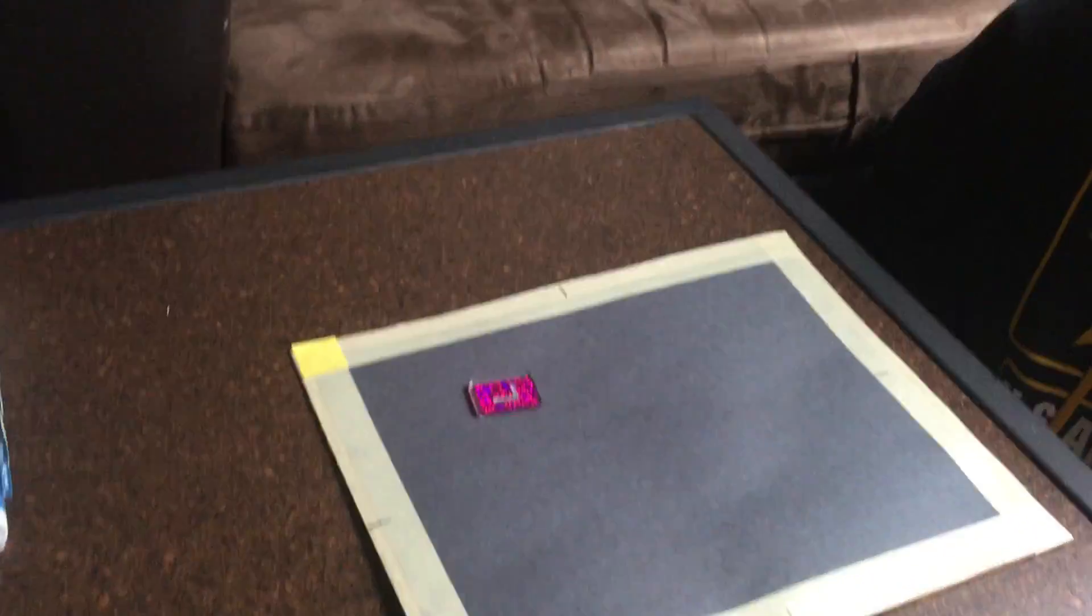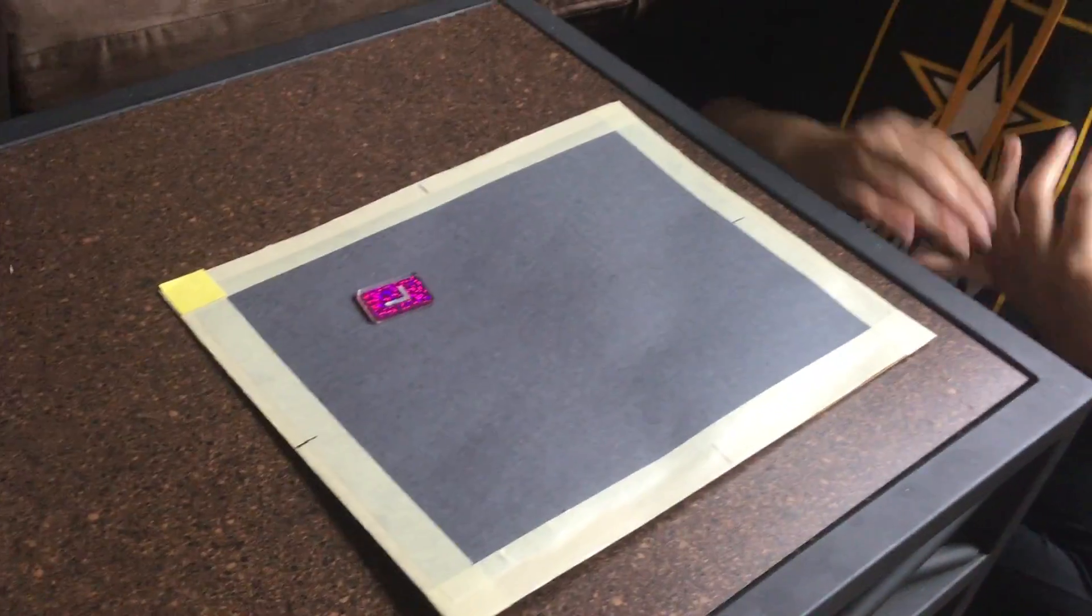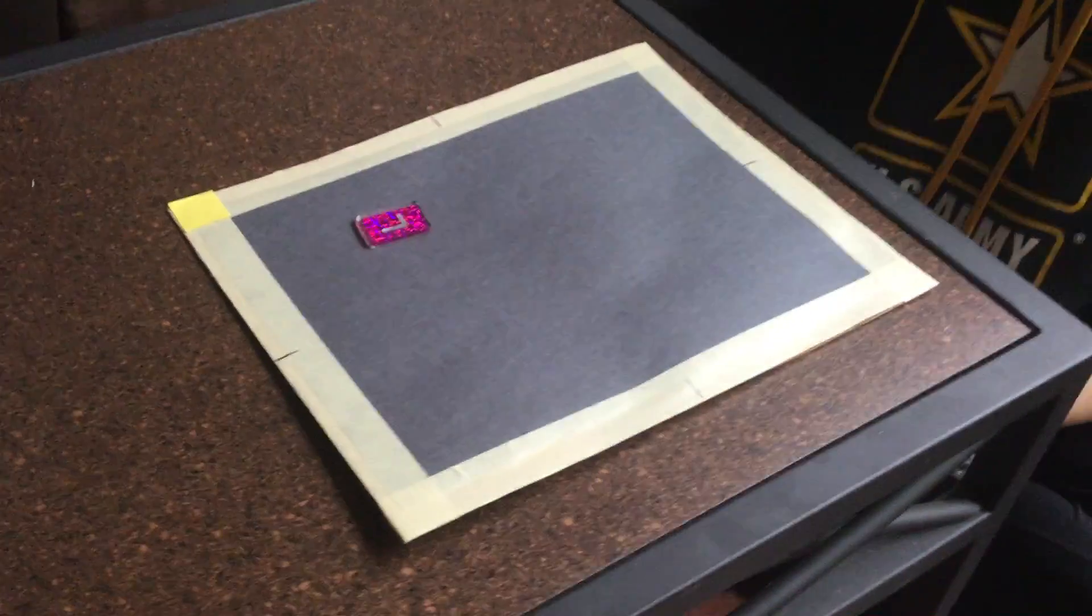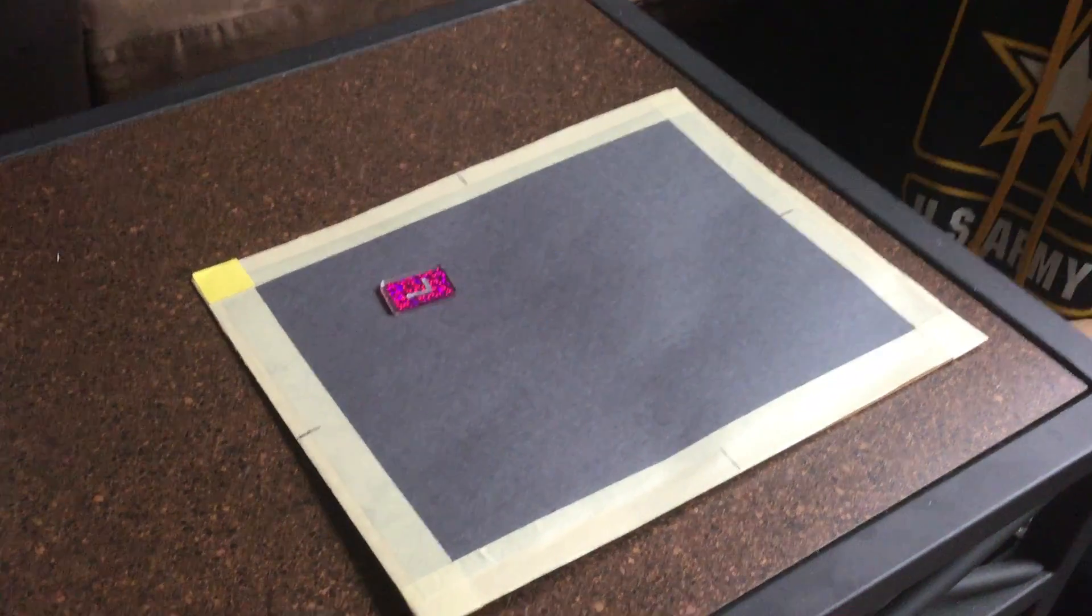So I'm going to be using a 10x12 cassette and the SID for all of these images is going to be 40 inches. I'm going to be using my left hand for the different examples and we're going to start with the PA wrist.